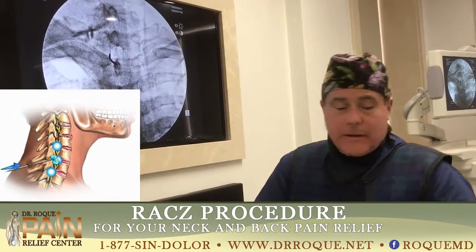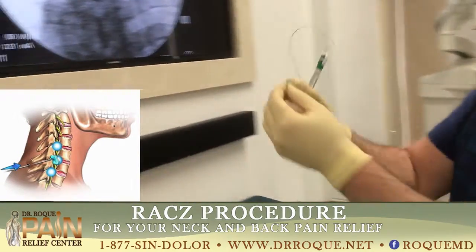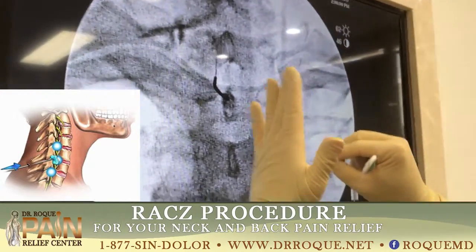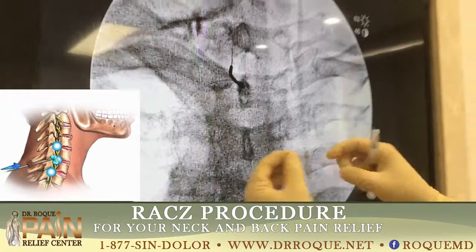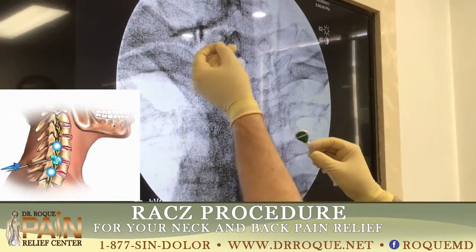As you can see, this cable is very flexible, and it doesn't cause any kind of damage to the nerves. And it's ready to release from there.